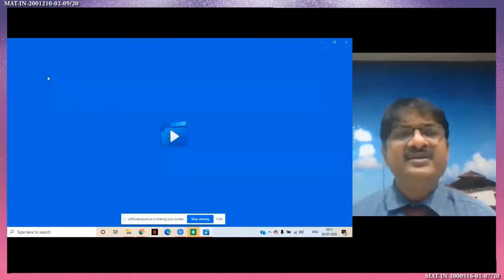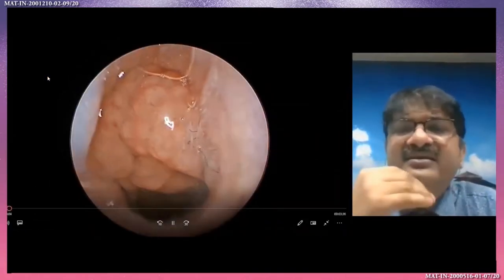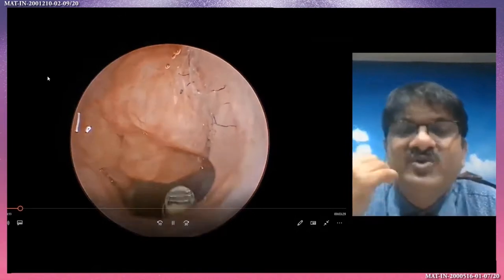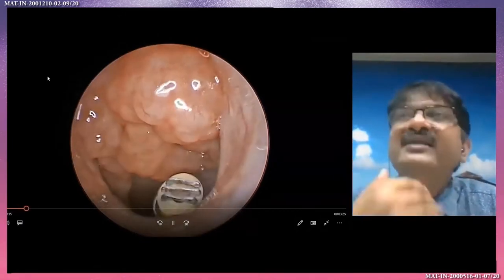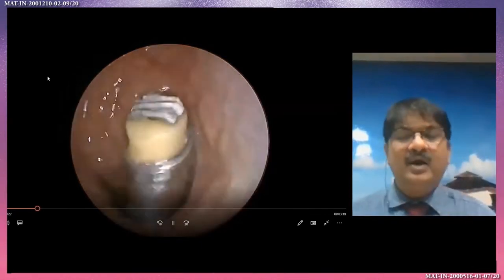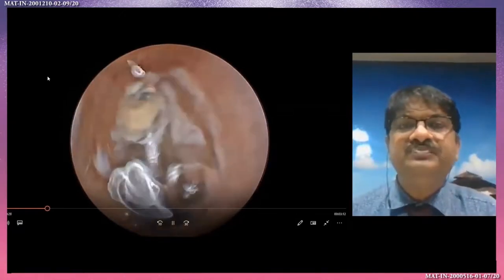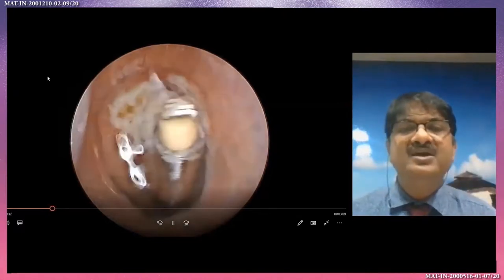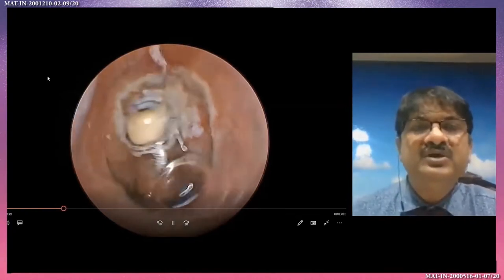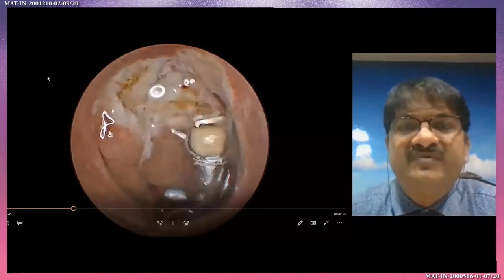Adenoidectomy with coblation is very important because there is a huge chance of residual adenoid with incomplete surgery. I am getting nowadays a huge portion of recurrent adenoid because the surgery was not complete — residual adenoid was there and without endoscopy you will not see that the adenoid is still there. Now the concept of adenoidectomy — from the full boundary of the adenoid — I will show total boundary removal with coblation. Zero recurrence — you will reach nearly zero recurrence if you follow this and check regularly for a few months.